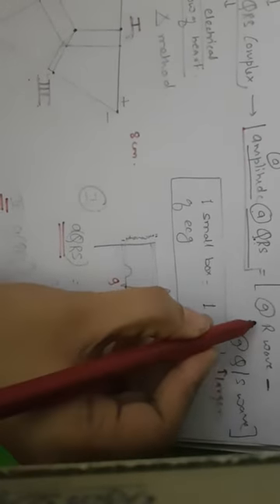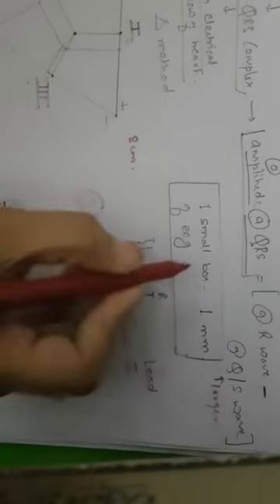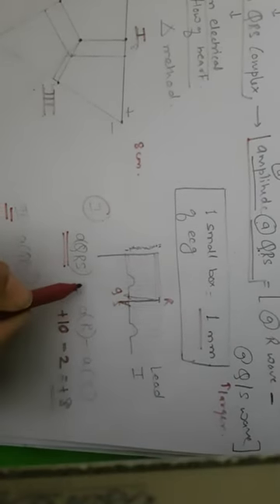Same way you have to find out the amplitude of QRS complex in lead 2 and in lead 3. So how to find out? You have to deduct the number of small boxes of Q or S wave from the number of small boxes of R wave. Okay, that is 1 mm, small box is 1 mm. So here we got in lead 1 it is plus 8.